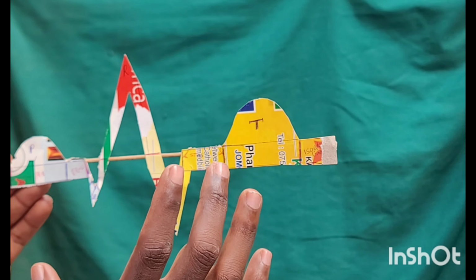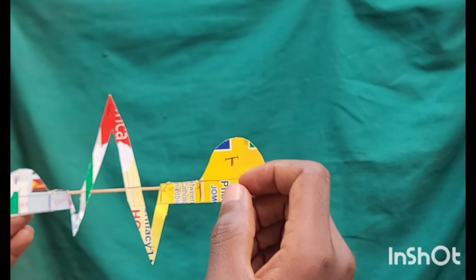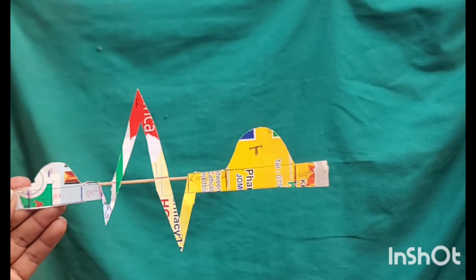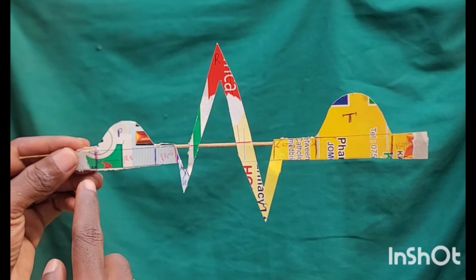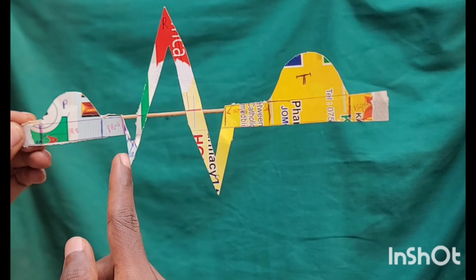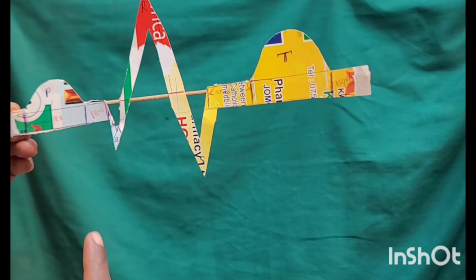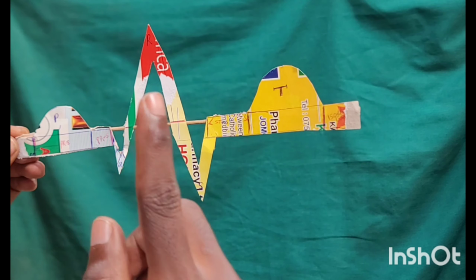And on average, it takes approximately 0.35 to 0.44 seconds. Okay? And then we also have another interval, which starts from the start of the P wave up to the beginning of the QRS wave complex. This interval is what we call the PR interval.